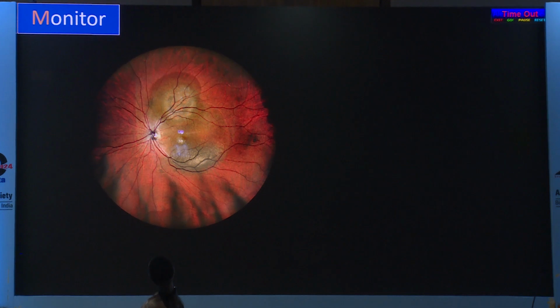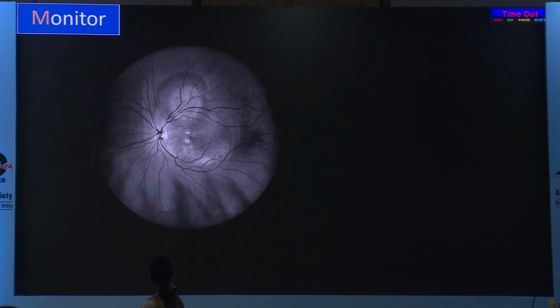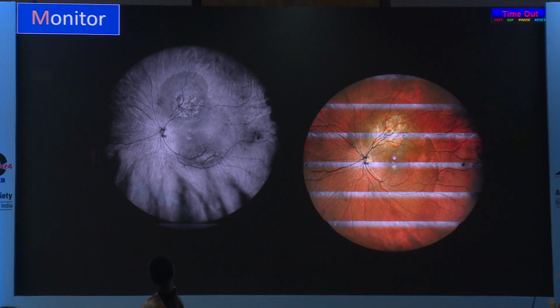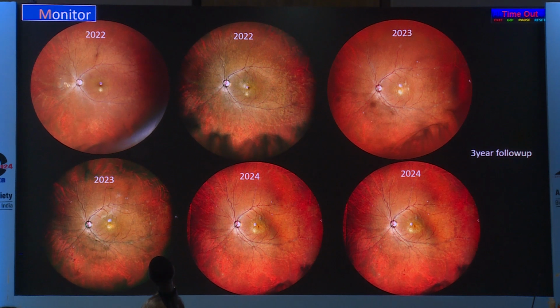Peripheral retinal tumors, an excellent tool to monitor their progression and regression following therapy. This secondary had a good resolution following chemotherapy. Vasculitis monitoring again is extremely important. This gentleman I followed up for almost 3 years. He was an oncologist by profession.